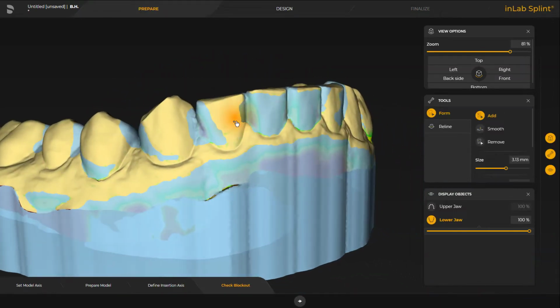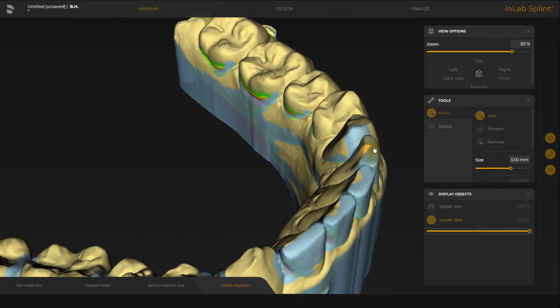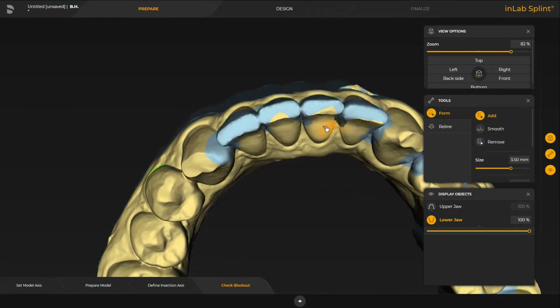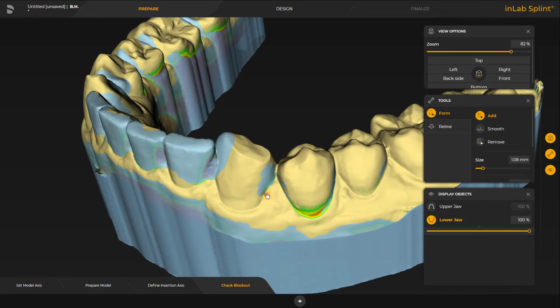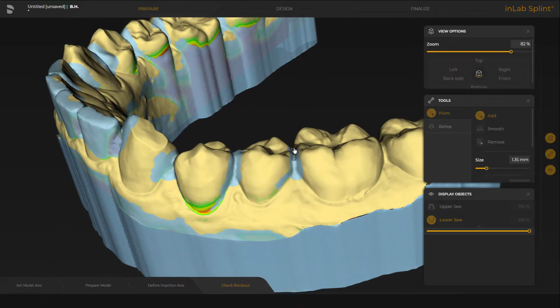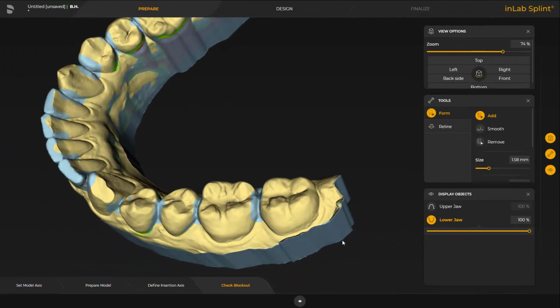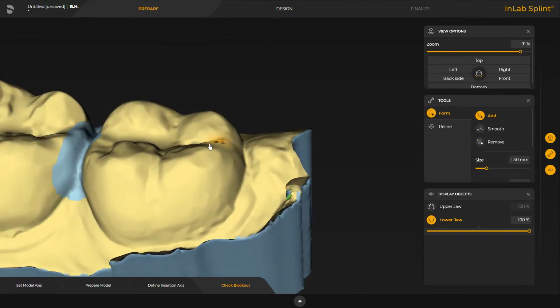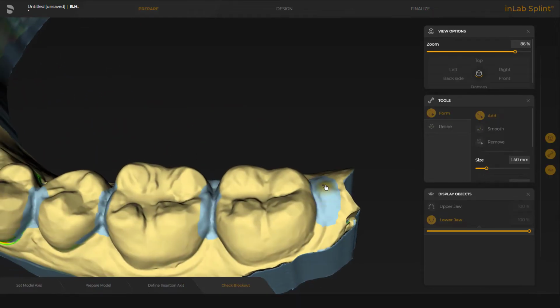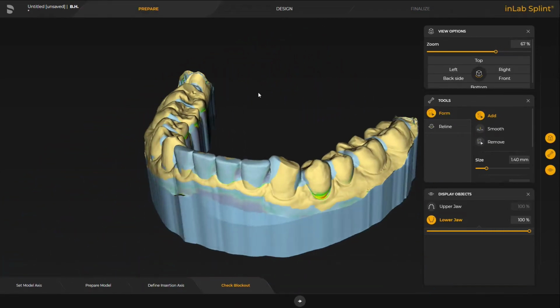To give the patient the possibility to relax or even push the teeth a little bit, we are going to increase the space in the anterior teeth. So if the patient is grinding very heavily, the teeth could move to the front now. Same here on the distal side, when the guard will be pushed down. We could increase the spacer here on the gingiva so it's not touching in case the patient is pressing it down.